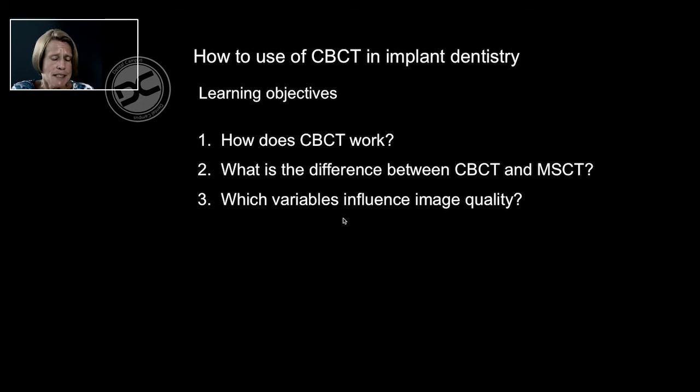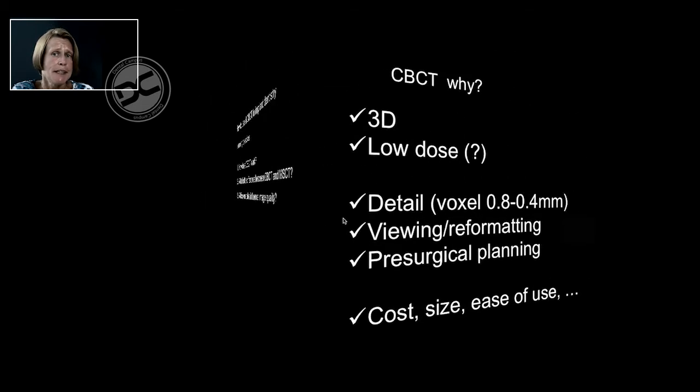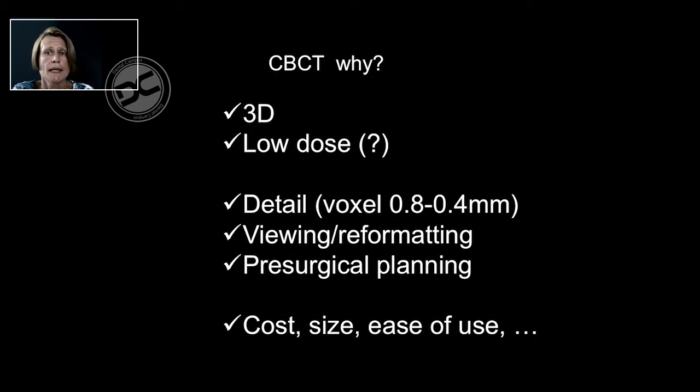Now, CBCT has become very popular in dentistry. One can question why. One of the reasons why it's popular in implant surgery is because it offers a 3D, low-dose image data set, although nowadays with CT you can also obtain a lower dose.